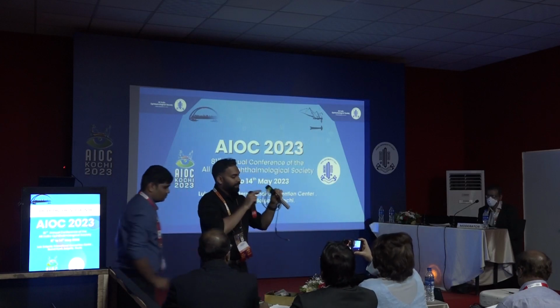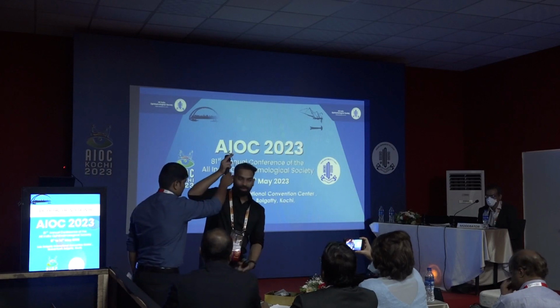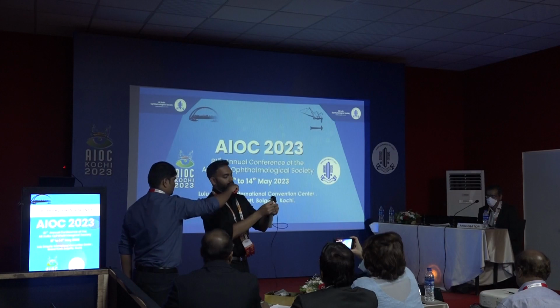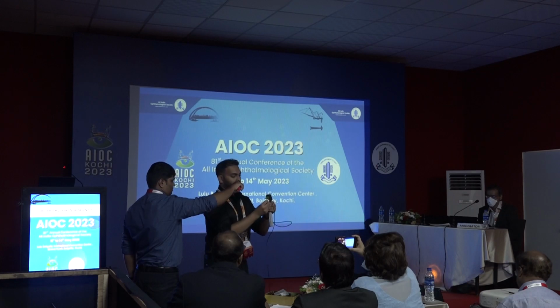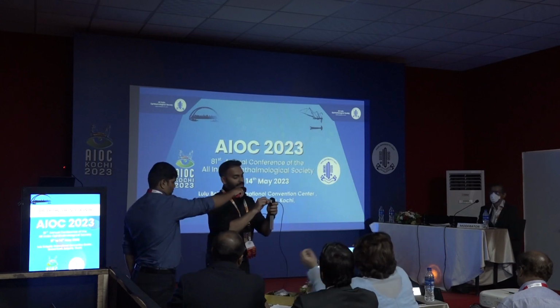So this is the camera which we are using. Yeah, this comes on Amazon. This small endo camera comes at around 1,000 rupees. You can just put this in. This is actually a 3D model, and then you can just fix it over here. This one is the retinoscope, and you can just fix it over here.